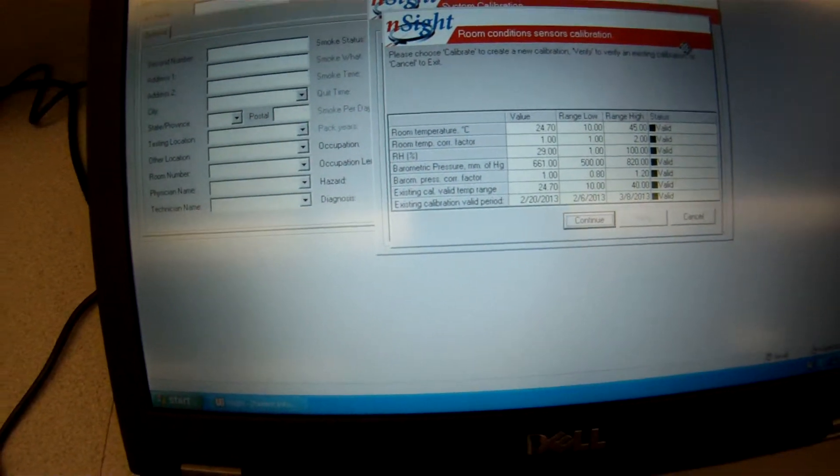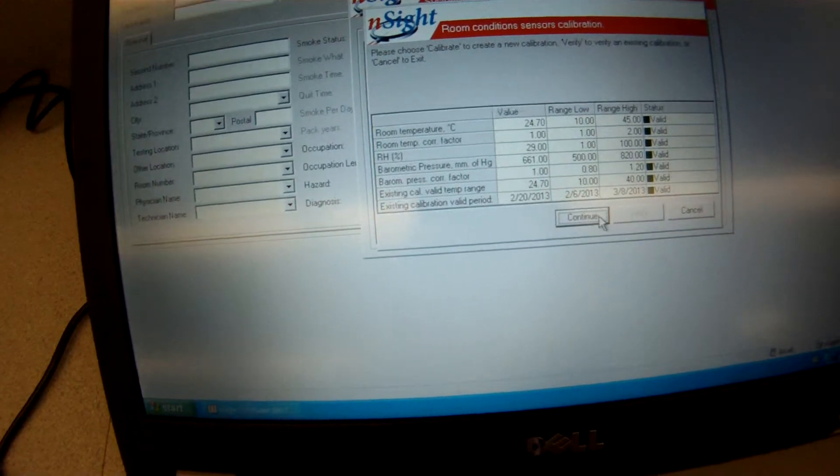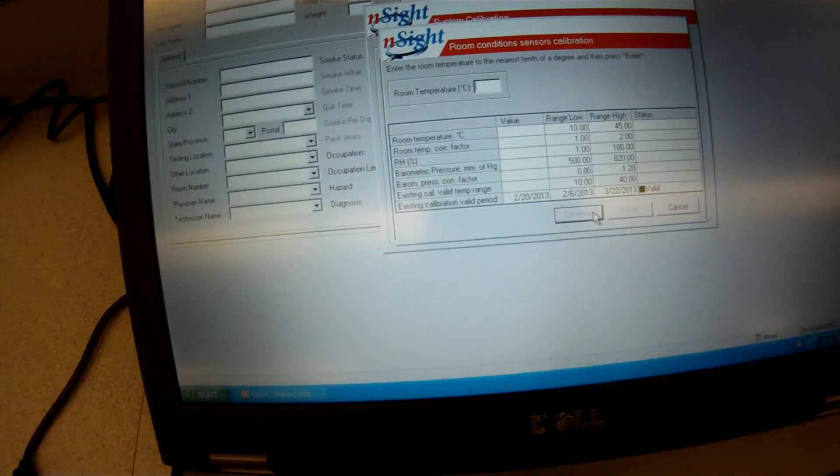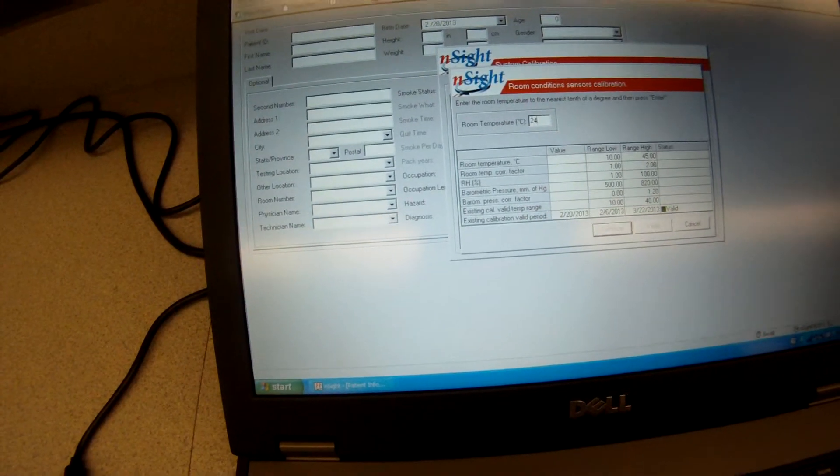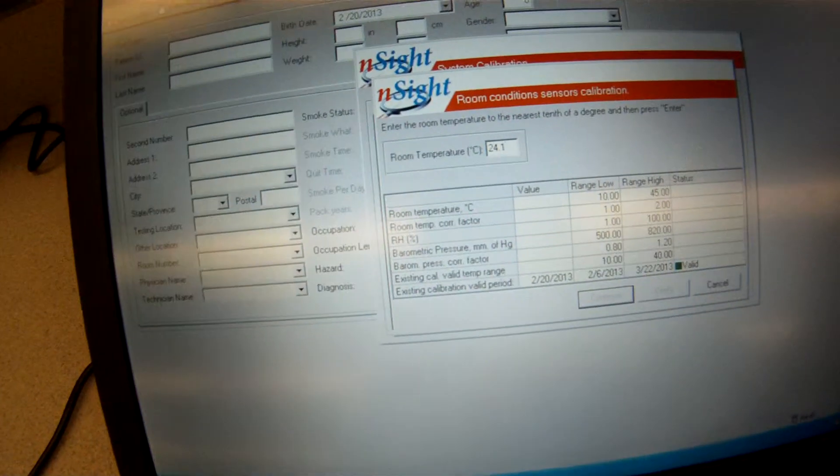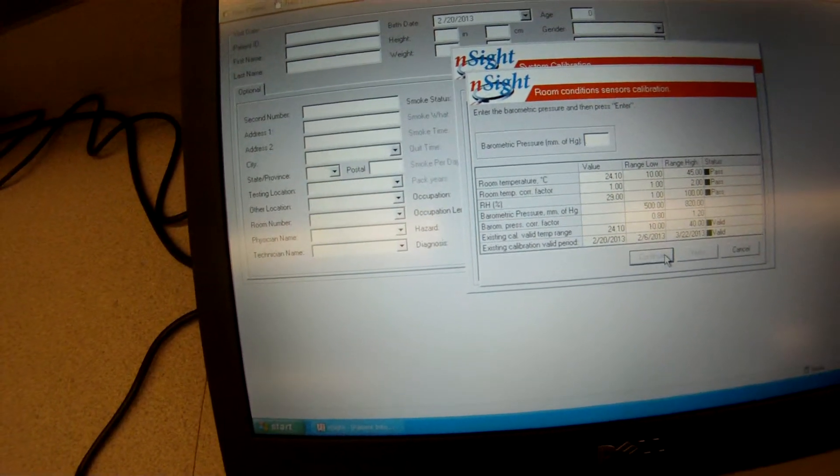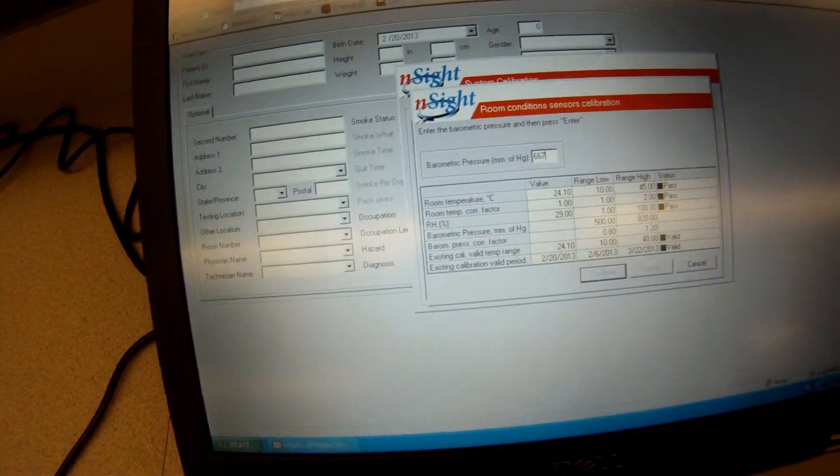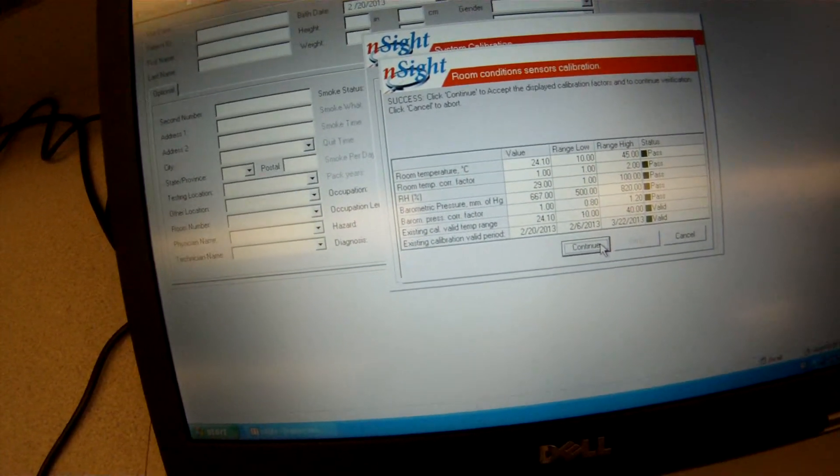It comes back now and asks us what is that. So we're going to go continue and we actually put in the temperature. The temperature today is 24.1 in this room right now. It's pretty warm in here. The humidity is 29 and the barometric pressure today is 667. So we enter that and then we go continue.